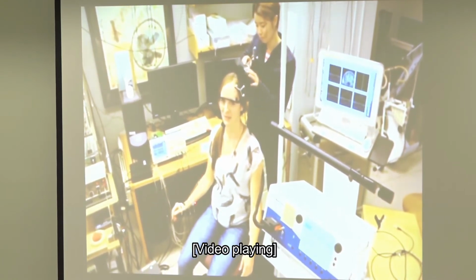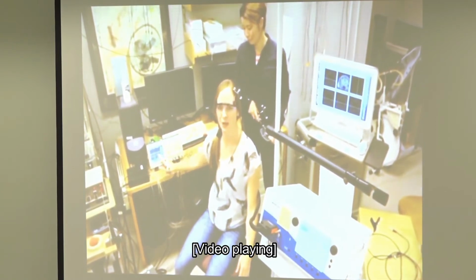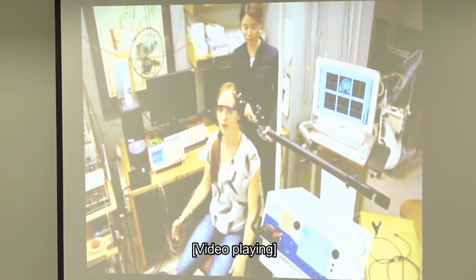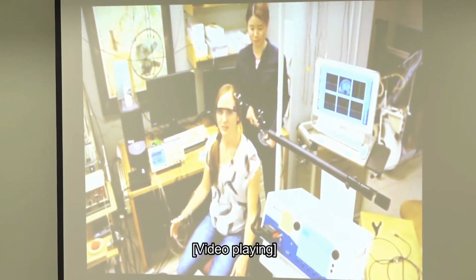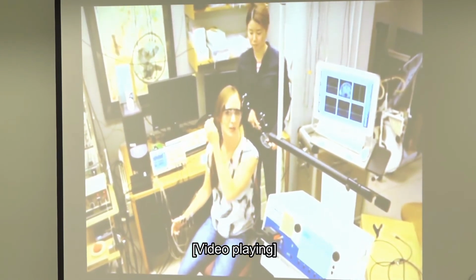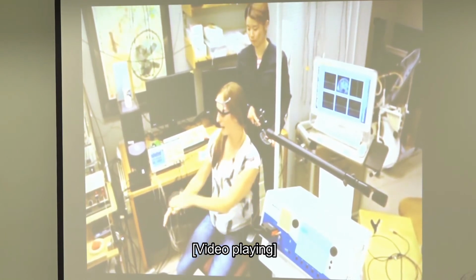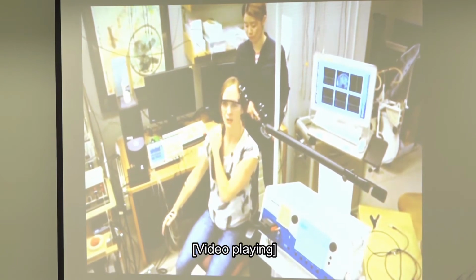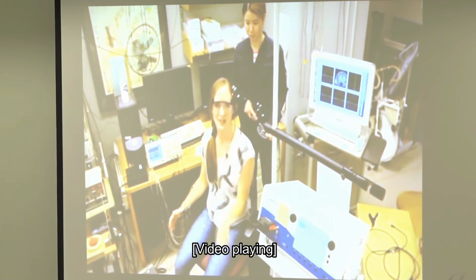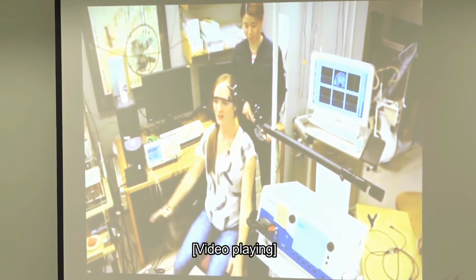Oh, so you see the hand, my arm twitch there. And we can also see this response over here on the oscilloscope because we've measured it using the EMG electrodes over the muscles of my hand and forearm. Now what we're going to do is move that magnetic coil over the span of my motor cortex from one side all the way over to the next. And what you'll see is muscles slowly recruited from my hand up to my elbow, shoulder, right leg. And after she switches hemispheres, we'll see some of the left leg come in and then down the muscles of my left arm. So here we go.